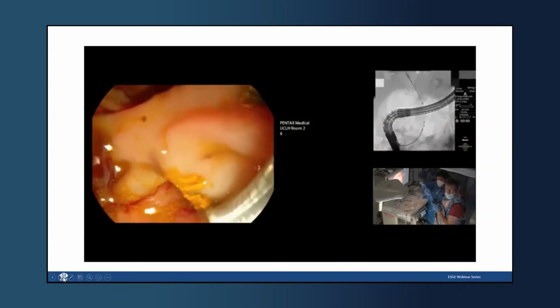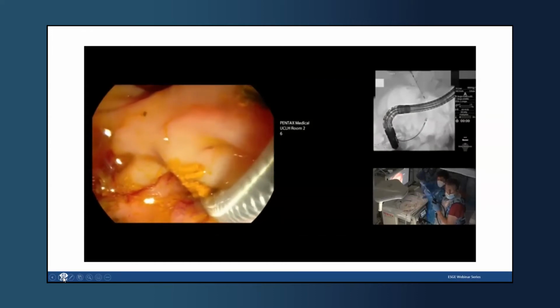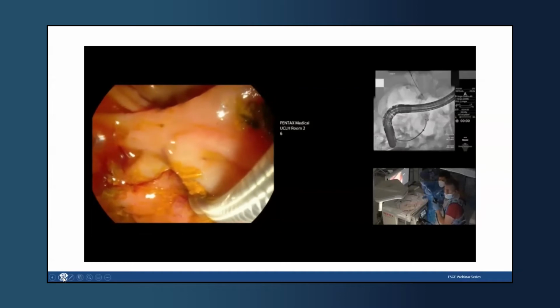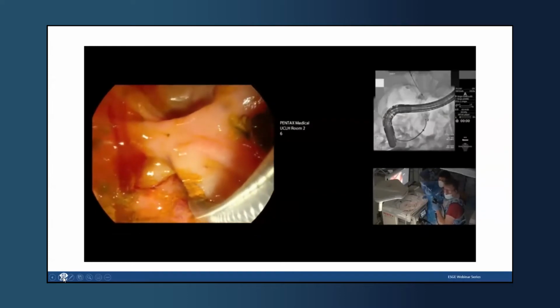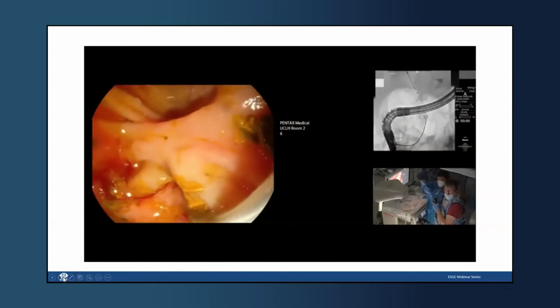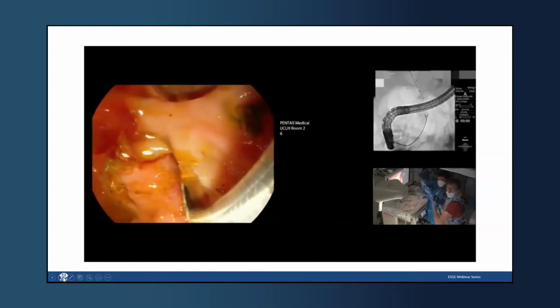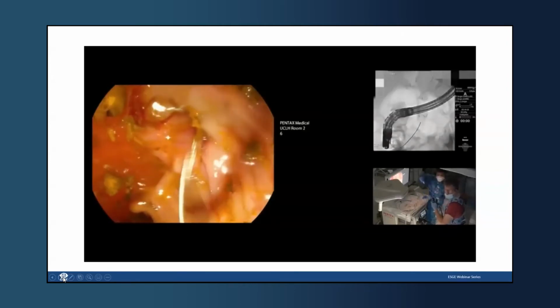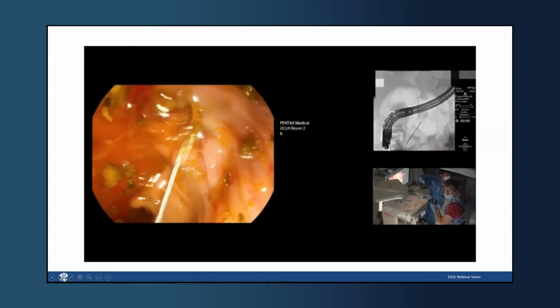And then I think you can just keep going. And it'll open. Ping. That's open nicely there. Take that picture. I'm going to slowly come out. Well, you're fully deployed, aren't you? Screen, please. You can keep going, but we're just going to come out now and let that string release, and then we're good. And we just want to see that string falls down.